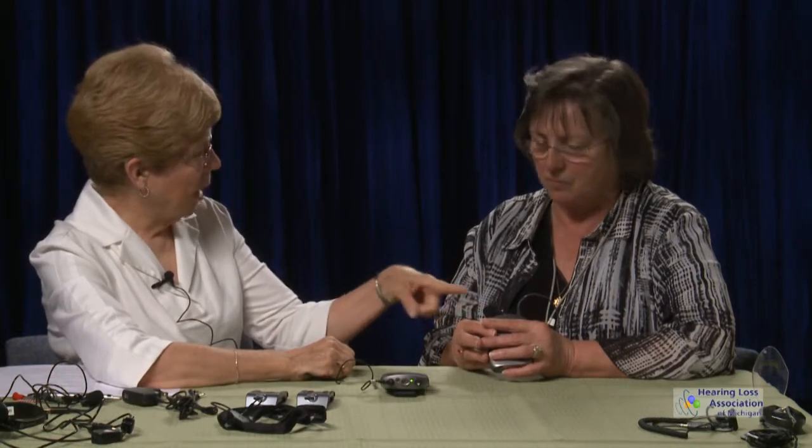Now going back to this microphone here, you're generally going to be sitting a great distance away from me. So this is an environmental mic. Let's say you're in a classroom and the instructor is wearing this particular microphone so that you can hear the presentation. Maybe a classmate asks a question, and hopefully they're close enough to you that you might be able to pick up that question with that environmental mic. Okay, now that's one of the purposes.